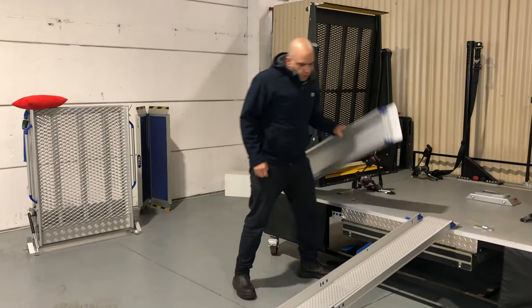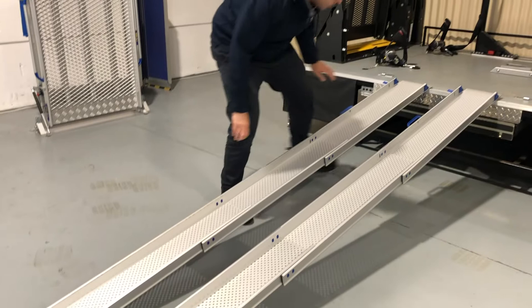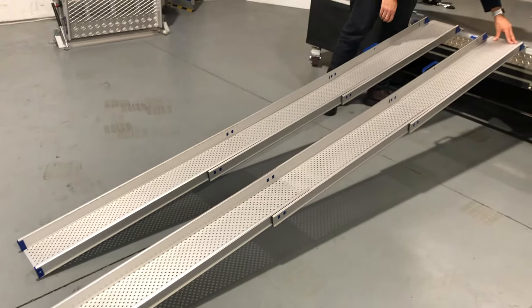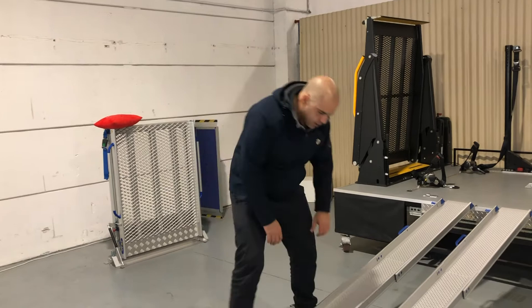We'll get the second ramp out and pull that open as well. They have a gripping surface underneath so they can grip the back of the vehicle, so there's no fear of slipping while you're using them. As you can see, I'll go ahead and extend it fully and line them both up.